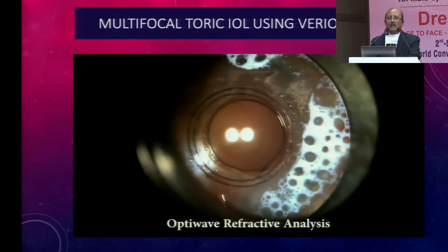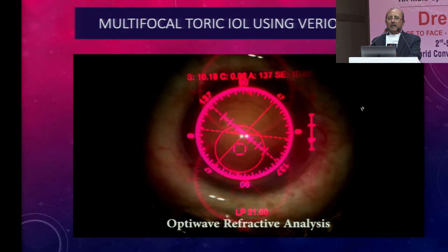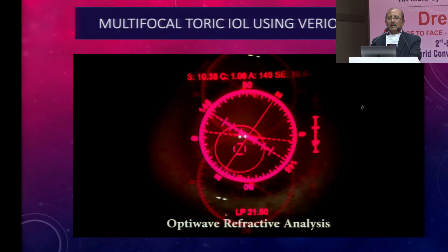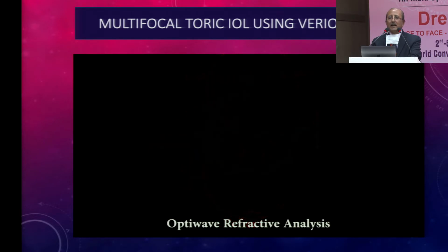IOL. Here see this intraoperative aberrometry, and it has to be absolutely accurate, including IOP and everything.